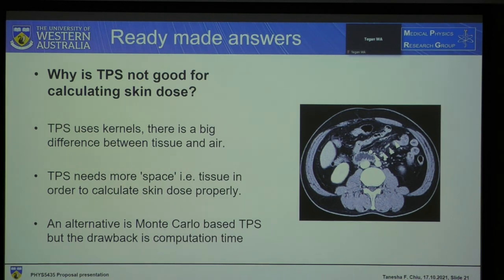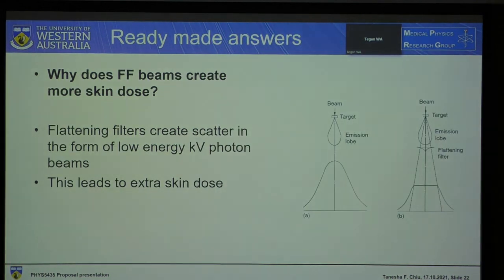Martin, questions? So in a linac beam, normally incident, no masks or anything, what parts of the radiation contribute most to the skin dose? What parts of the beam? So if you're talking about, say, FF and triple F beams, then I believe I actually have a slide for that.